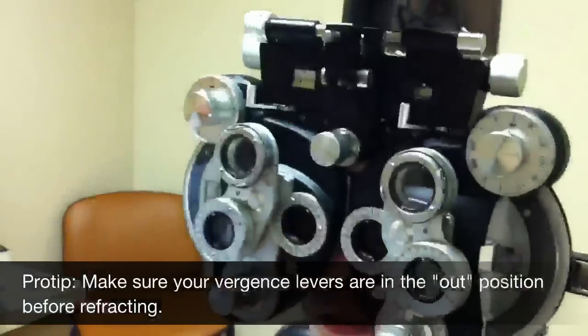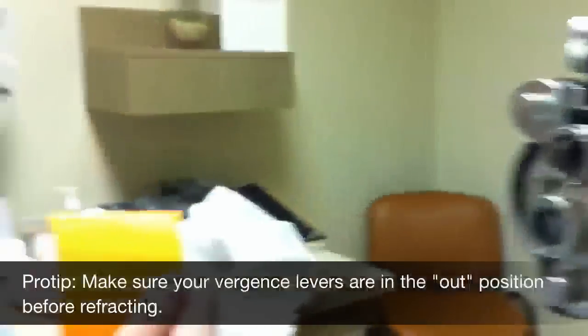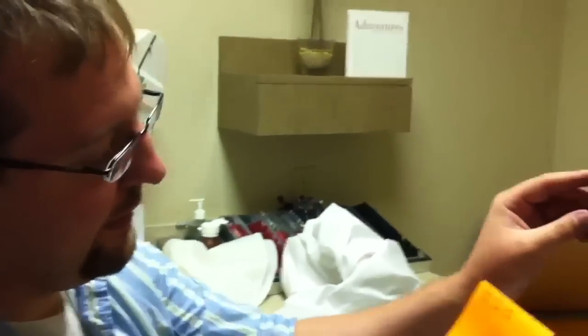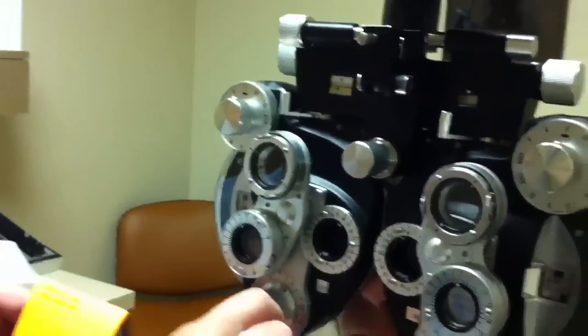All right, so this is going to be how you refract. I took a look at her glasses, and this is what we got. She's a little myopic with some astigmatism, so I'm going to put the prescription in here first.